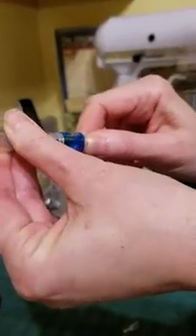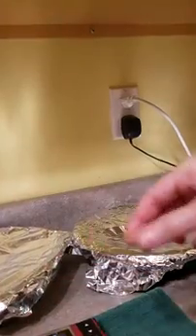I'm going to open my alcohol wipe. Going to clean the top of the insulin bottle. Can I poke it? And I was always told you take the cartridge, you take this little thing, and you take the blue thing, and you pump it a couple times, and you get it ready. And then you stick your needle on. And Michaela wants to do that, so I'm going to let her put the needle on.